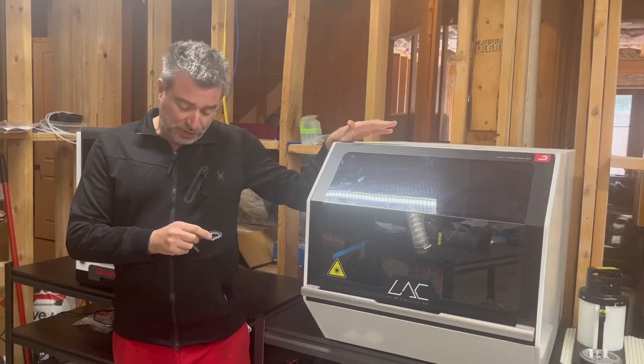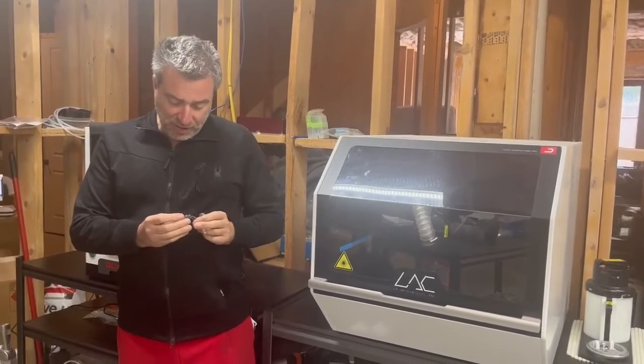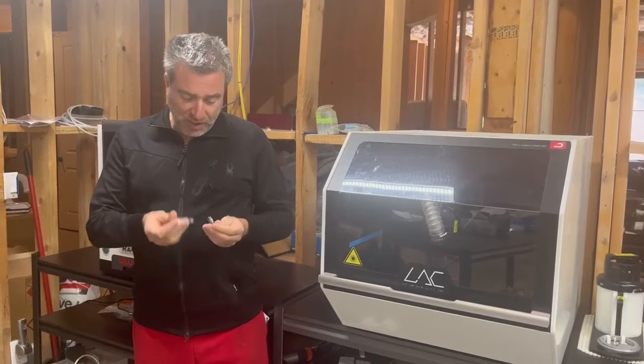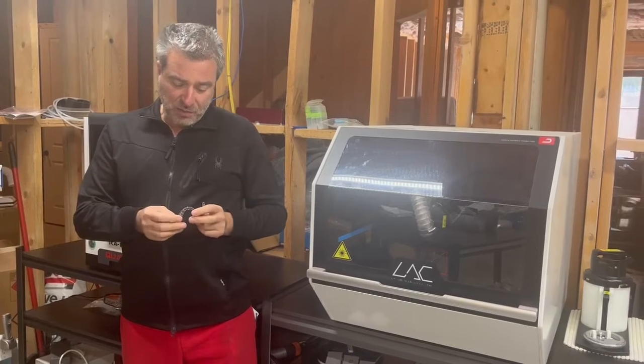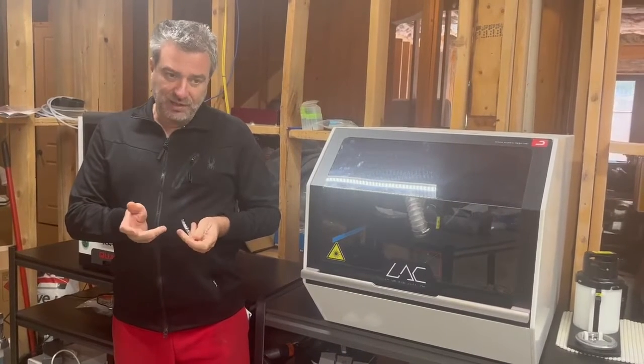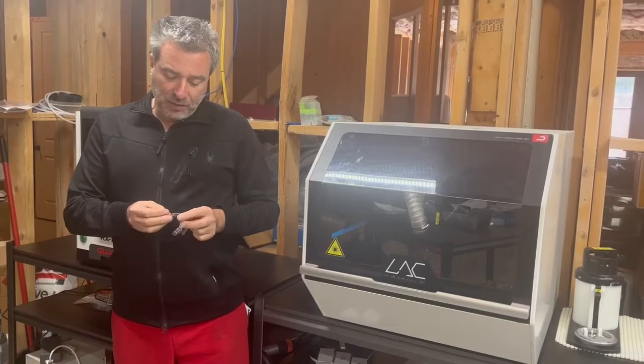Yes, I do own a few cutters — six to be exact. This is just two right here. Another point is, as I said, we average about 500 cuts per burr. That's under $10 replacement cost. These were done after about 300.